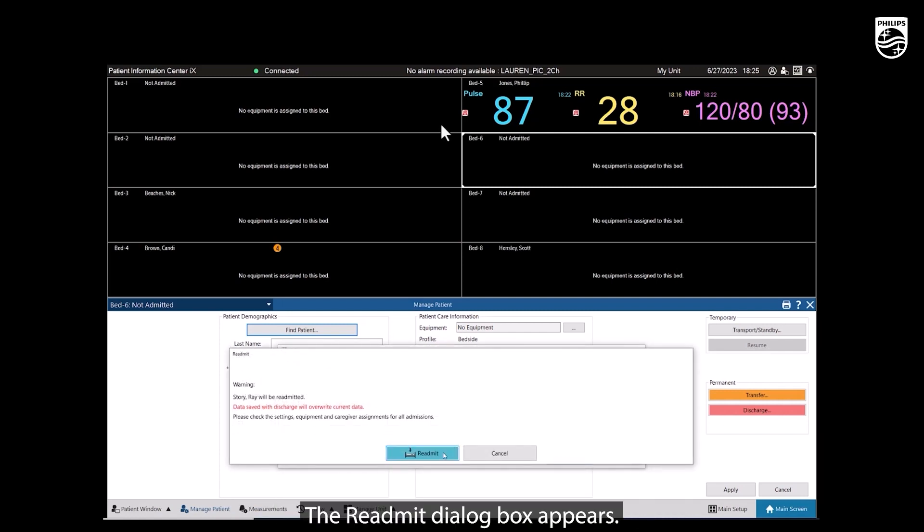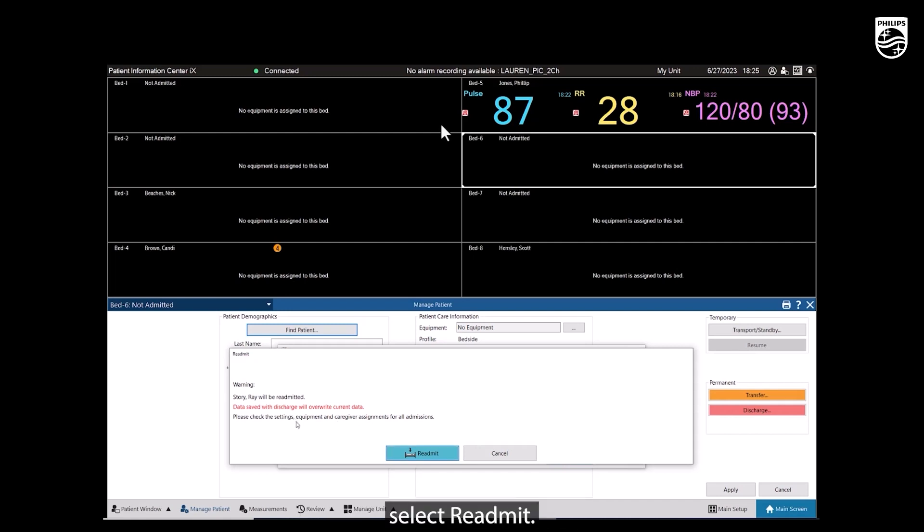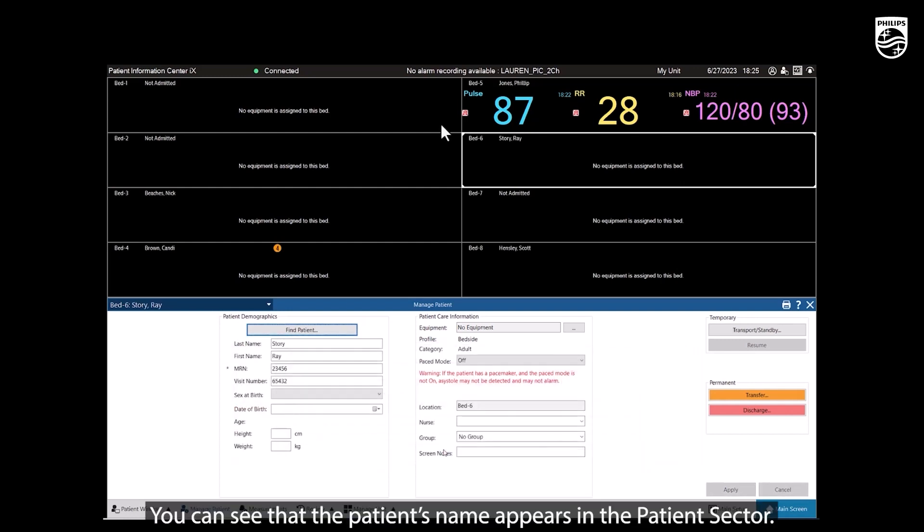The Readmit dialog box appears. Carefully read the warning. Select Readmit. You can see that the patient's name appears in the patient sector.